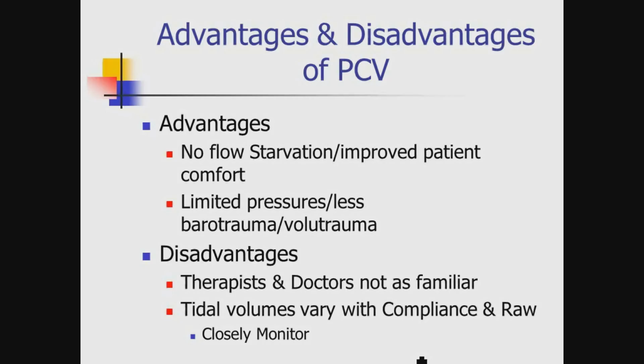Because I'm limiting the pressure, theoretically at least, there's less barotrauma, less fear of having excessive pressures being applied. Another advantage has to do with better gas distribution throughout the lung. At the end of the inspiratory phase, remember we said you had this rise in flow initially, and then as it fills the lungs, it slows down. Well, that ending portion helps disseminate gas to the periphery.